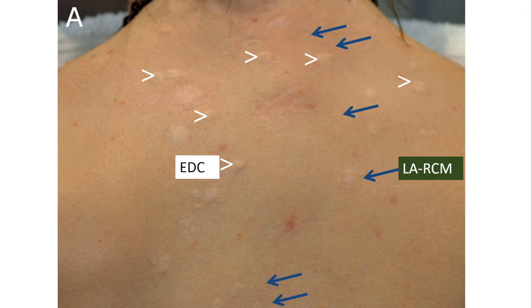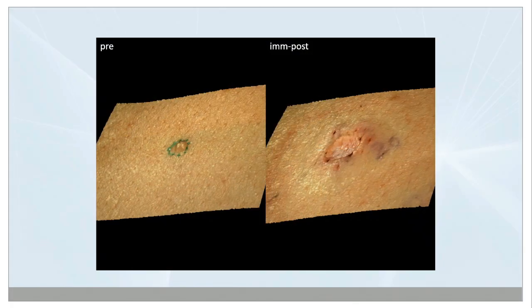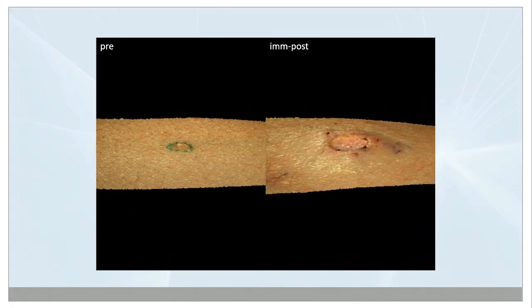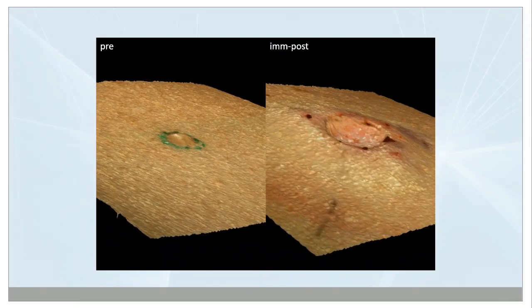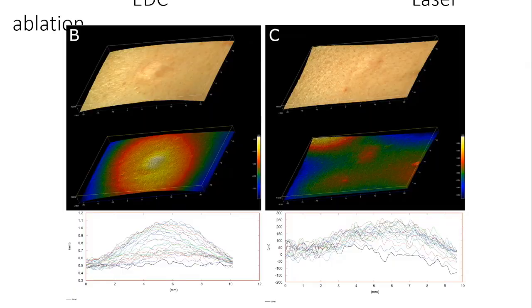So these are surgical scars, these are ED and C scars, but the green shows you a laser ablation guided by confocal microscopy scar, which is, we use lasers to treat scars. So the scarring is different from laser ablation. And then just using neat and nifty imaging tools, we could show the difference between a pre-laser ablation, immediately post-laser ablation, and then afterwards they're healed.